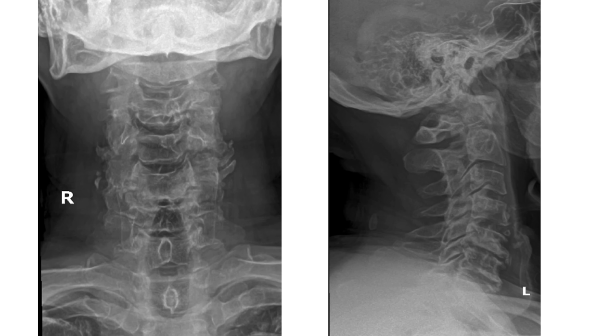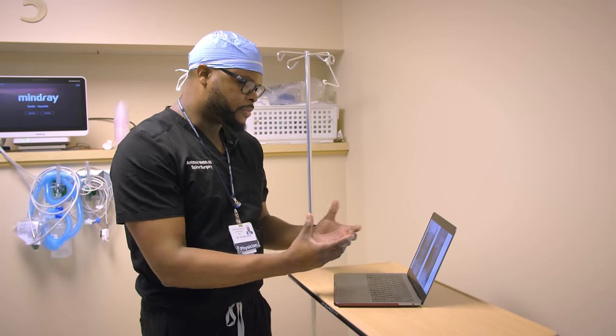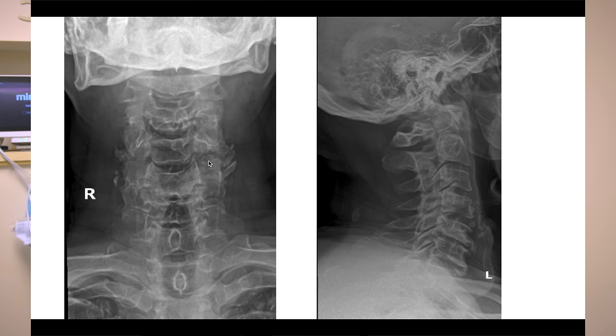These are the patient's x-rays here. They show that he has severe arthritis and collapse at multiple levels in his neck, and severe osteophytes, which are bone spurs. This is the AP view — the anterior-posterior view — and also the lateral view, where we're looking at it from the side.